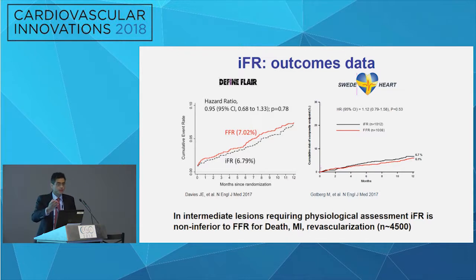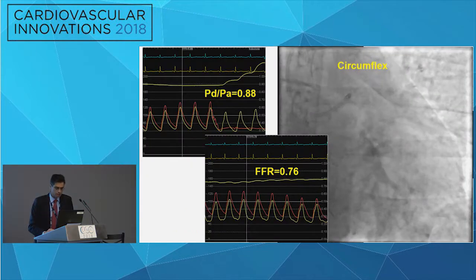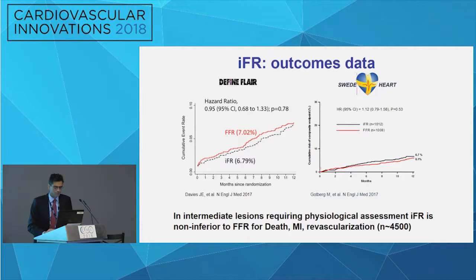But that's actually a good point, because I think that comes down to the data. So the question is, and I see your point, someone did a trial with 4,500 patients, and that's important, of course. But you've seen all this correlation data before, that there's a correlation of 0.99 or 0.98 between DPR, the diastolic pressure ratio, and iFR. So if it's essentially a very similar measurement, you still wouldn't use it because you don't have the outcomes data. And I'm not saying there's a right or wrong answer here. This is more of a personal approach to things.